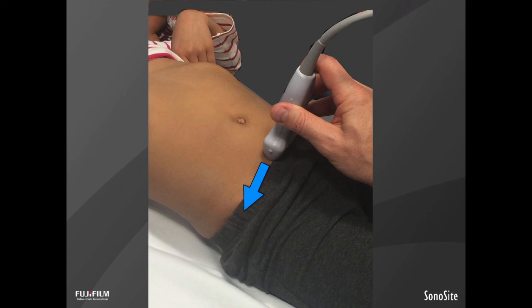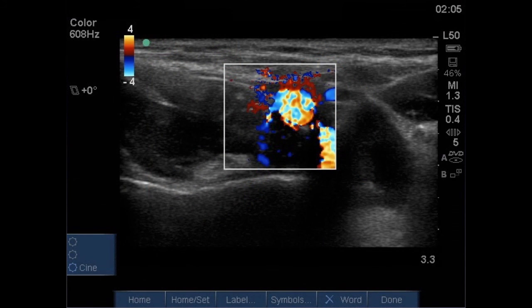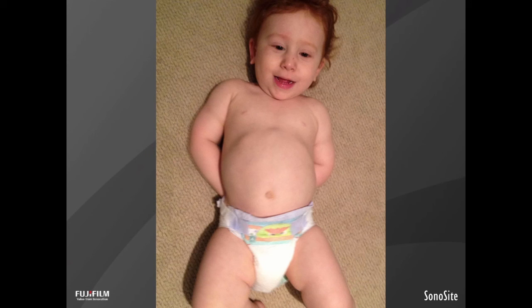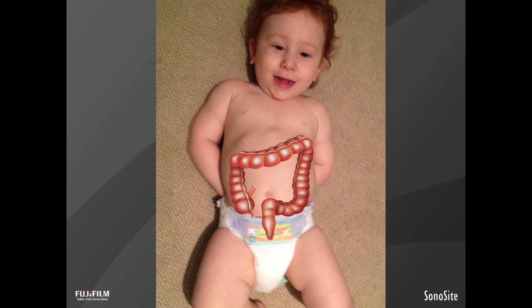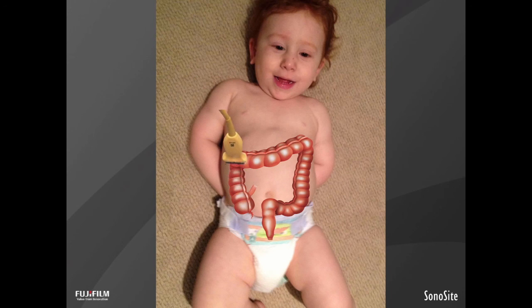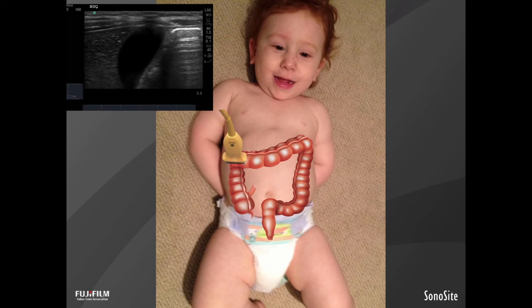Our next step is to move the probe over to the patient's right side. The view of the bladder puts us at the appropriate transverse level. Keeping that view of the bladder, slide over to the right side and we're going to bring the iliac vessels into view. We'll also see the psoas muscle, which has a striated appearance, just over toward the patient's right lower quadrant. Just above the psoas muscle is going to be the cecum — that's our starting point as we move up the right side to the ascending colon. Once we identify the gallbladder, that tells us we've made it to the hepatic flexure.